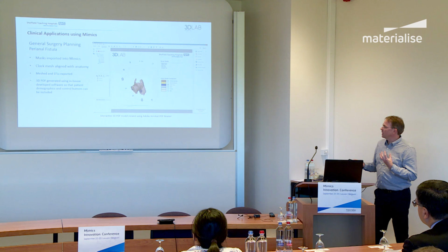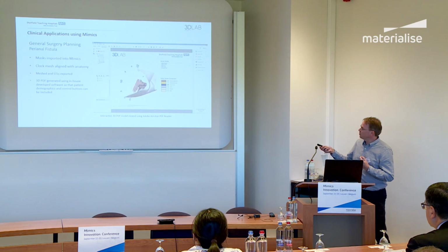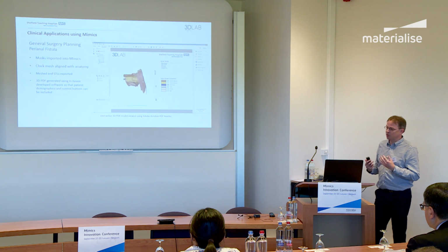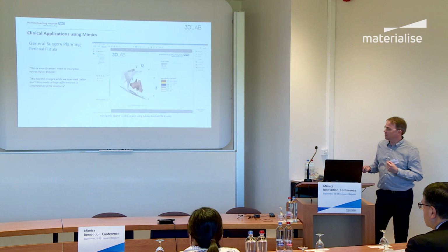And this is then what we pass to the surgeon. They don't usually spin it this quick. But we've also added a number of buttons on the side of the PDF so that the surgeon can more easily control the visualization straight from the screen. And those are some of the comments that we're getting back. So the surgeons absolutely love this.